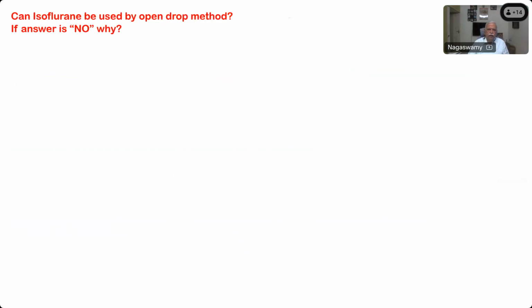Now, can isoflurane be used by open drop method? The answer is no. Why? Again, this is a repetition of old concepts I have told you already. Saturated vapor pressure, is it high? Vapor concentration, how much it will be?